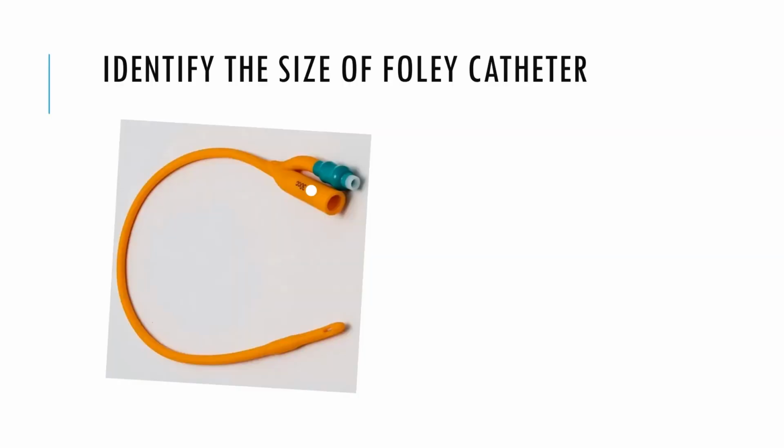So the first one is: identify the size of the Foley catheter. Again, it's a very important question where they can ask you the question in different ways. They can give you the number and ask you the color, or they can give you the color and ask you the size, like that. So we have to remember the different colors of the Foley's catheter and their corresponding sizes.